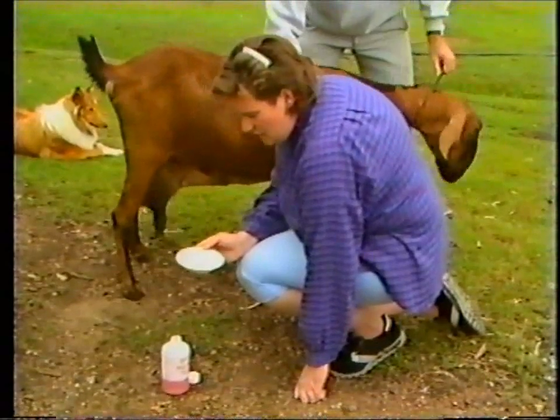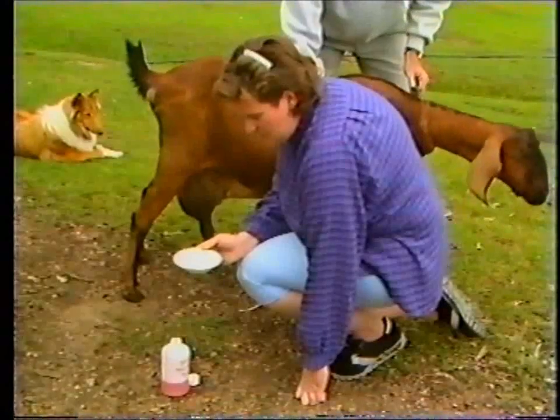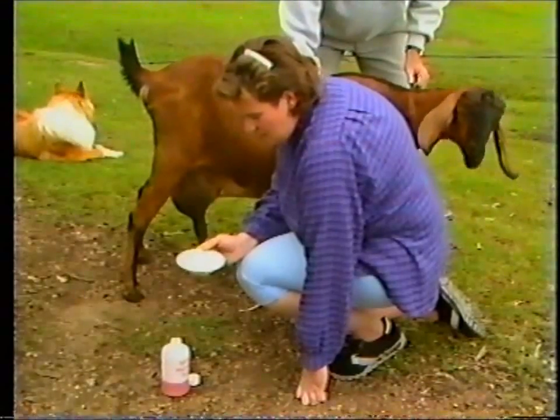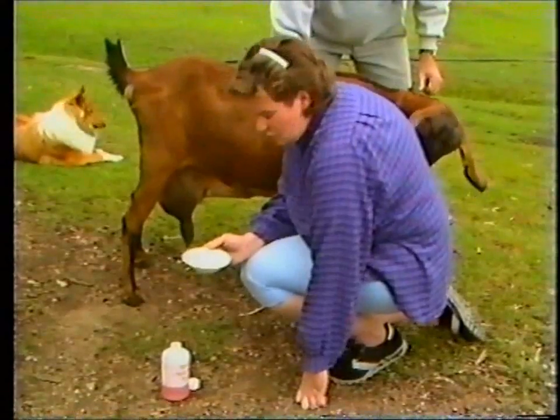If the mixture forms a gel, it indicates that mastitis may be present. In this case, the result is negative because the milk just looks like a strawberry milkshake.